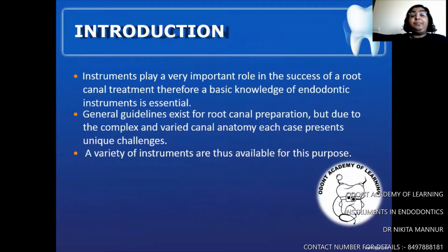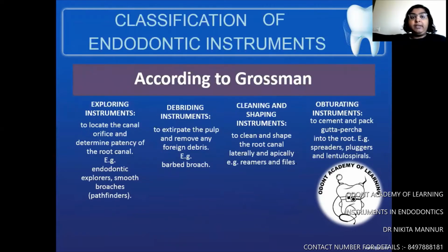Coming to the introduction, instruments play a very important role in the success of root canal treatment. Therefore, it is very important to understand how the instruments work. We have a general guideline for root canal preparation, but every canal is different, and there is a lot of variation in the canal anatomy in each case that we see. Therefore, root canal preparation presents unique challenges in different ways. We have a variety of instruments available in the market for this purpose.